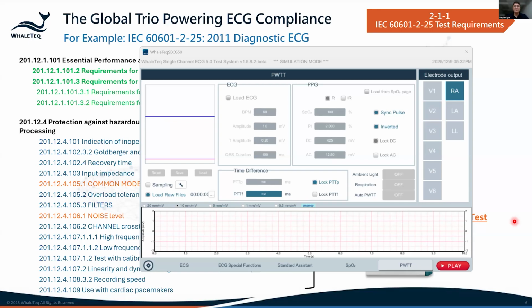Just so everyone knows, the -2-86 standard is the synthesized standard that combines the three we're talking about: 25, 27, 47. They're still draft. Once they complete it, we will release the standard software for that. As far as we know, there is not much change in the hardware, so there will be no problem. Probably just one more optional standard software can solve this.